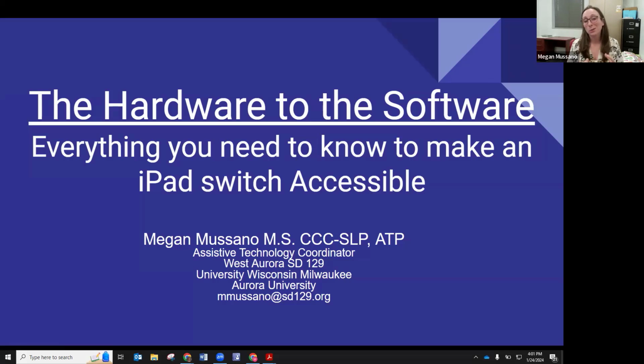It's going to be a quick, informative presentation, and I would strongly recommend that when you try all these techniques and strategies yourself, just refer back to the notes. There's a lot to give you all about hardware and the software and how we can turn that into communication also. Don't be scared that I'm a speech therapist teaching all about switch accessibility.